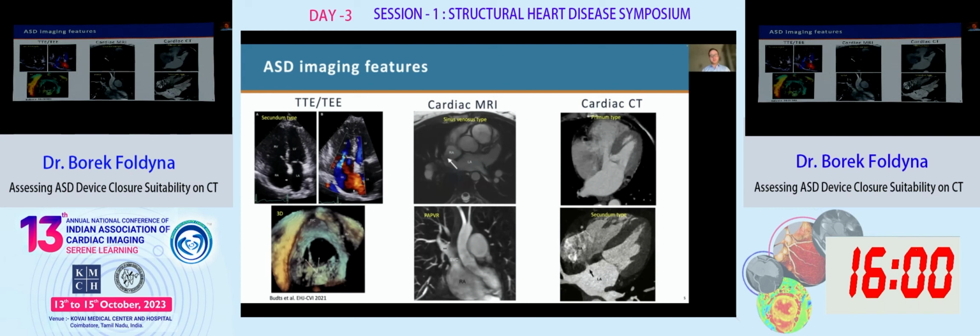Here you can see 2 examples of atrial septum defects with contrast flowing from the left atrium into the right atrium. Here, a large defect on a cine image, and we see how the contrast is blushing into the right atrium. Here, a small defect, this is a type 2 defect, with a little kind of a tunnel or connection between the left atrium and the right atrium.